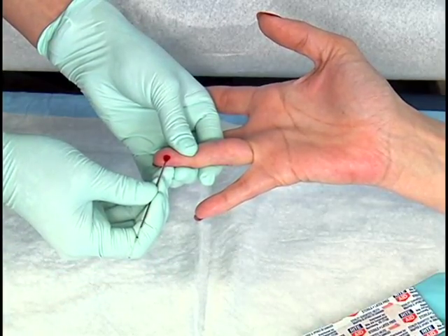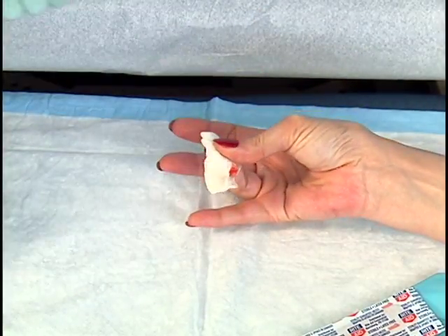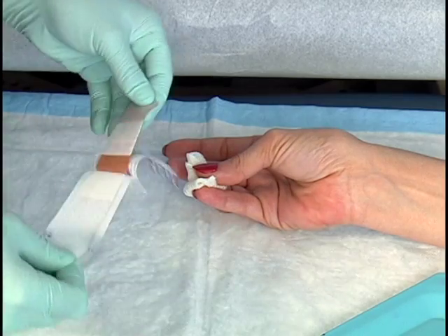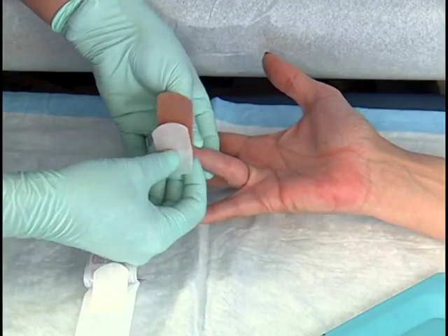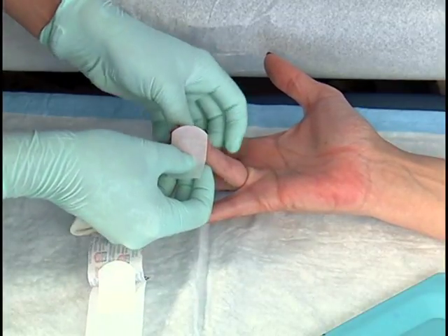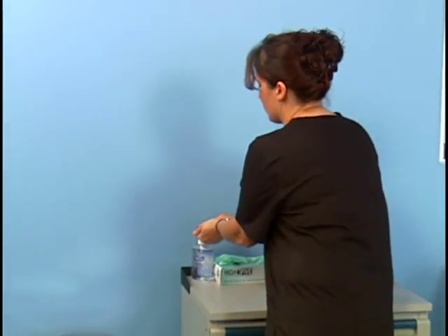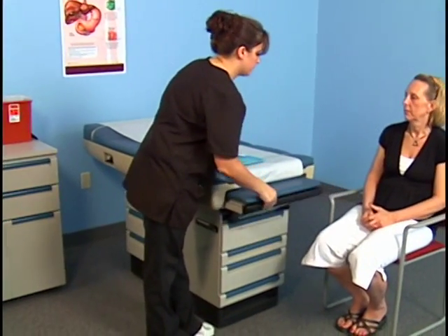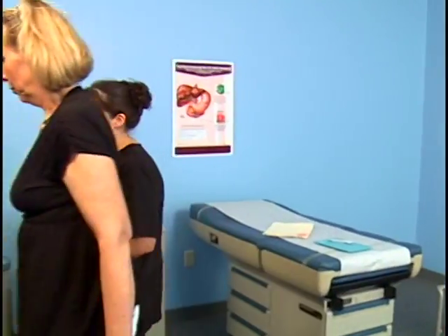Ask the patient to hold a gauze pad over the puncture site and apply pressure until the bleeding stops. Process the blood specimens by sealing the hematocrit tubes with a sealing compound. As a safety precaution, remain with the patient until the bleeding stops. If needed, apply an adhesive bandage. Remove your gloves and sanitize your hands. Transfer the capillary tubes to a laboratory work area and test the specimen according to your medical office policy.